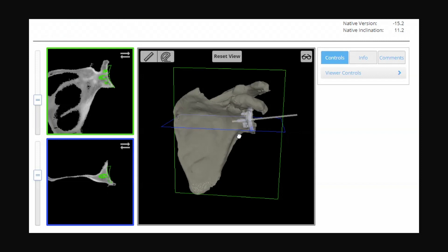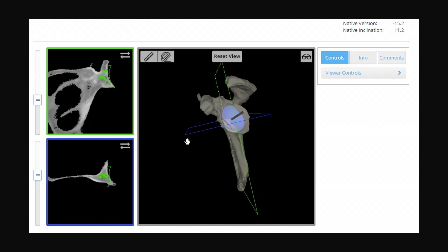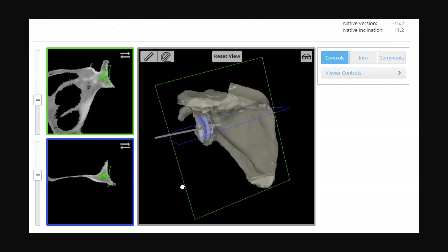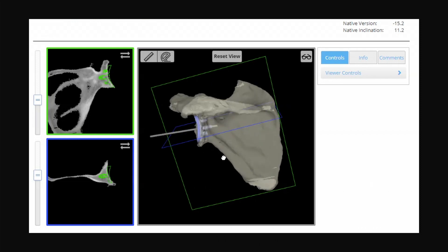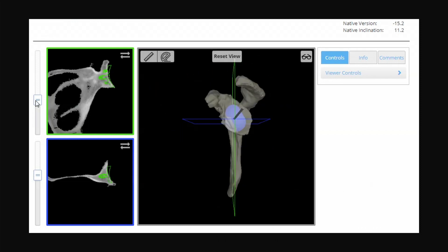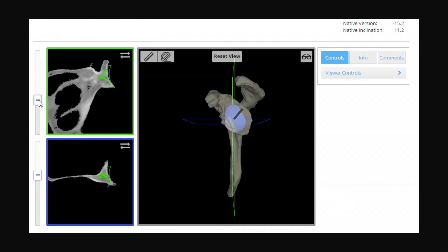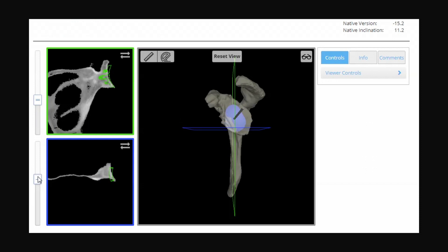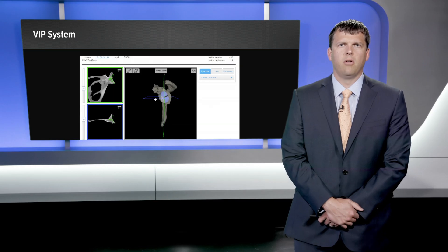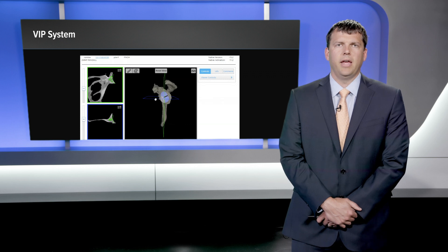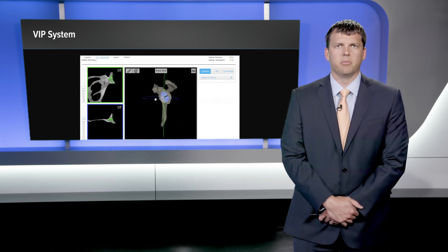Here we are in the VIP system. Our CT is uploaded and you can see we have a 3D replica of this patient's exact anatomy. In the corner we can look at coronal cuts and in the lower corner axial cuts with regard to where our implant is going to sit. You can also make adjustments in any dimension as to where you place your implant.